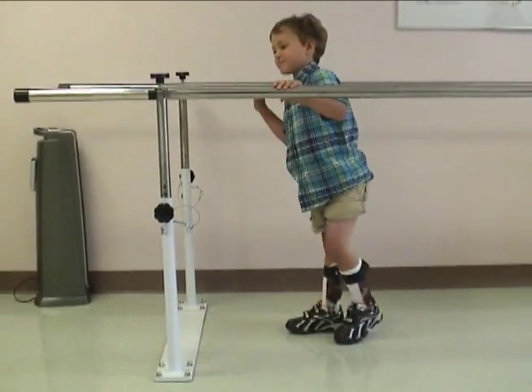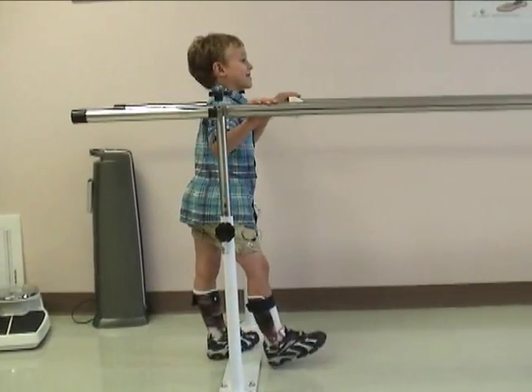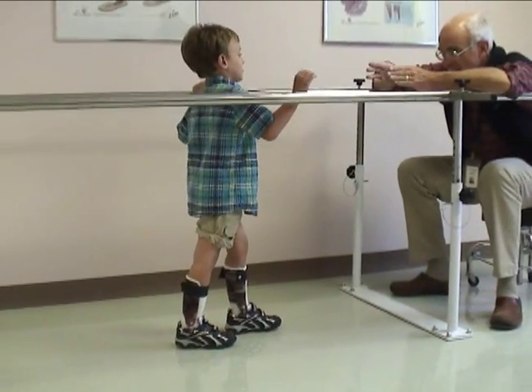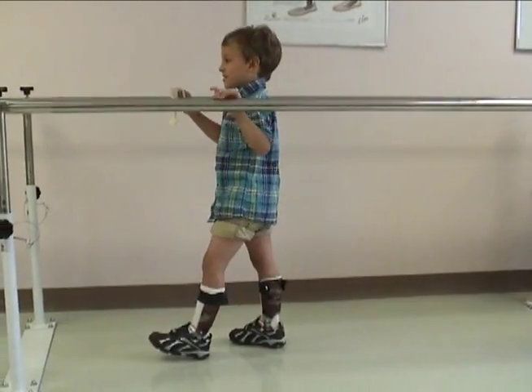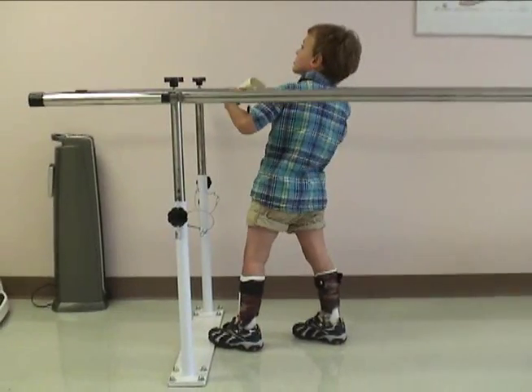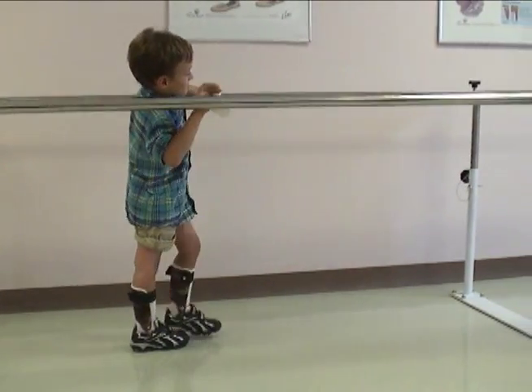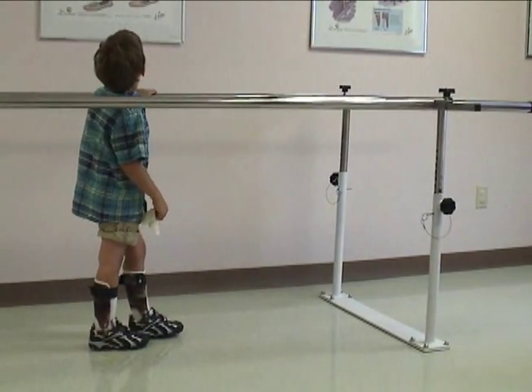I would have to say that my assessment of the initial walking in these braces was not very positive. Remember that our goal was to reduce or eliminate the hyperextension that Austin likes to use at mid stance. The initial view from the side walking in the parallel bars shows dramatic hyperextension, and he's moving through the resistance provided by the tamarack hinges fairly consistently. This was his first fitting in these braces, and he has not adjusted to the stability that the braces are providing and adapted his walking to this new situation.